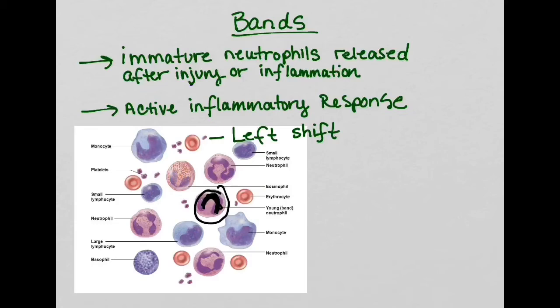If you've ever heard of left shift, there are a couple of different reasons why it's called left shift. One theory is that it's from documentation from years ago. People had a graph and you'd put the bands on the left side. They called it left shift. Another has to do with the shift of the bands being released versus the neutrophils.